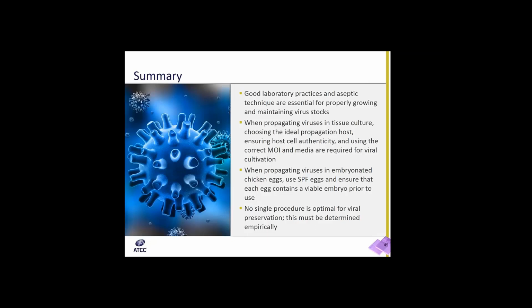There is really no single procedure that is optimized for virus preservation, and you have to determine this depending on the virus you're growing. So what we would recommend is to control the steps and processes where you can by using the best practices that we have mentioned in this webinar.